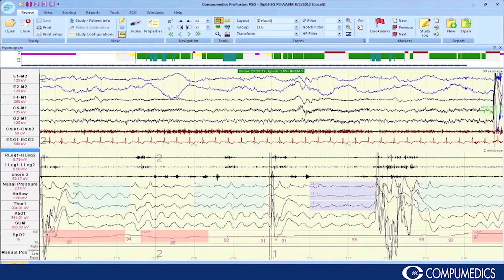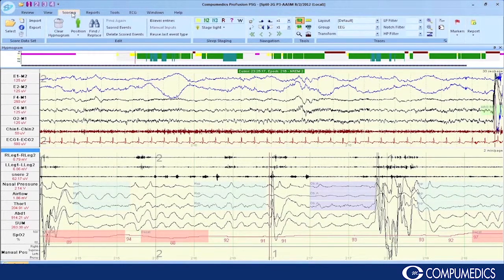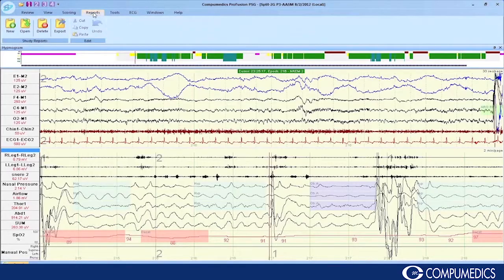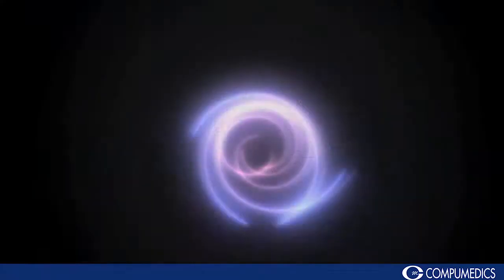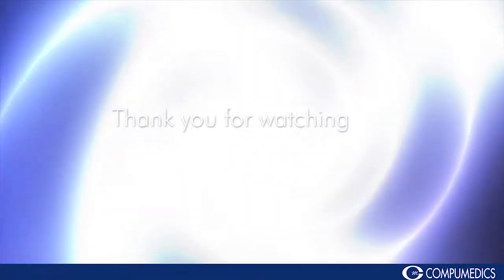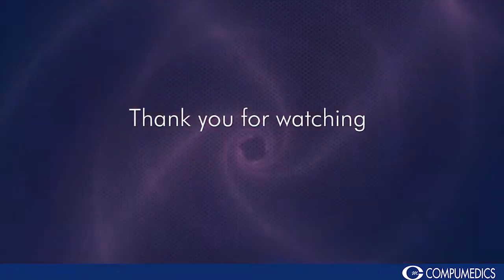ProfusionPSG also incorporates the new technology, providing easy to use tabs for reviewing, scoring, and reporting of PSG studies.